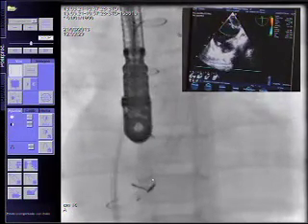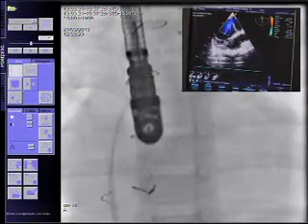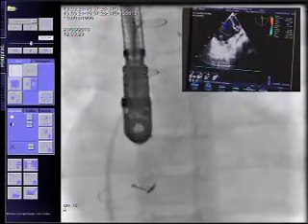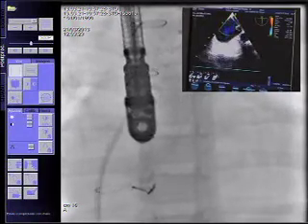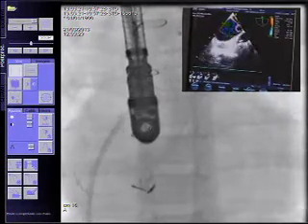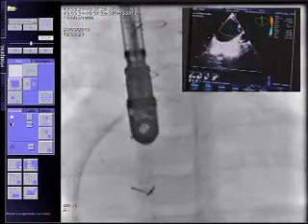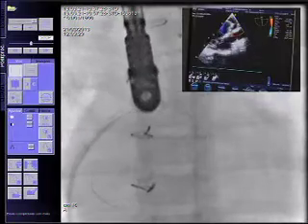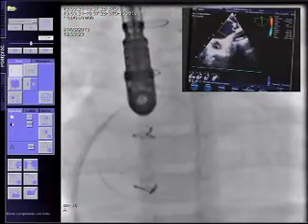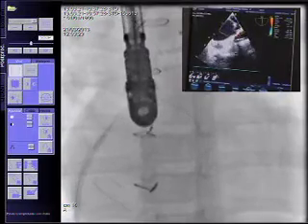Now I will try to advance the sheath through the guide, keeping the introducer in position. Once you've got the wire across, you probably could just go with a low-profile balloon, and that would be what you're going to do anyway. Yes. I can't, so I will perform an angioplasty there.